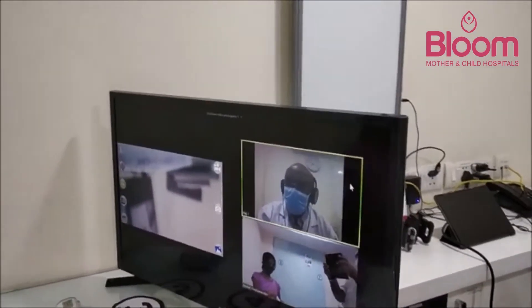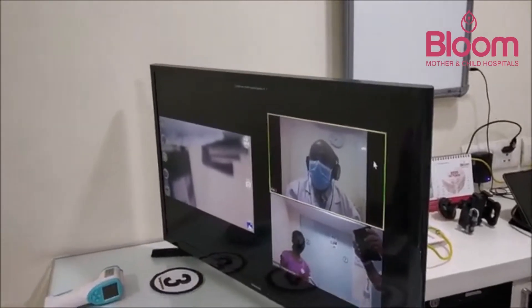Using the digital stethoscope, the doctor is able to hear the patient's heartbeat and breathing sounds clearly from the remote room.